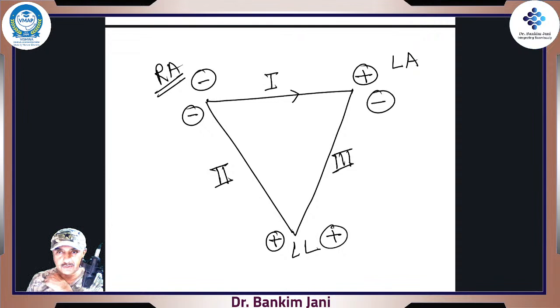We have got 3 leads. So to the patient, we just put one electrode here, one electrode here, and one on the left leg. But you might ask that, okay, at times we have seen one more electrode even on the right leg. Well, that is a dummy. That is a dummy, right? So that to avoid the confusion that, okay, all 4 leads are kept, right?